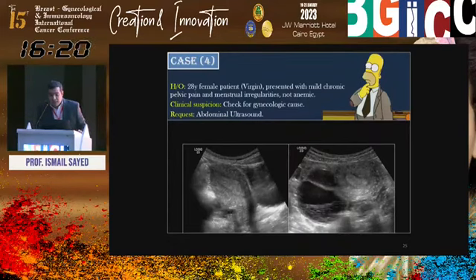Another case, 28 years old, virgin. Virgin, so I cannot perform transvaginal approach, but I can still use the probe. I'll tell you in a minute. Mild pelvic pain, menstrual irregularities. I'm looking for a gynecological cause. Yes, we should ask about dysmenorrhea, dyspareunia, especially dyspareunia. And during the examination, actually, look at vaginal wall while withdrawing the transducer. This is very important. It can solve a dilemma for the patient.